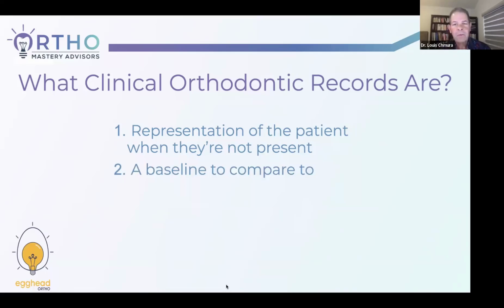The second thing they are is a baseline to compare to. So as you go along, when you're looking at pictures along the way, or you're looking at the patient along the way, you can always refer back to where you started. And you want to be able to tell exactly where you started in all the dimensions.